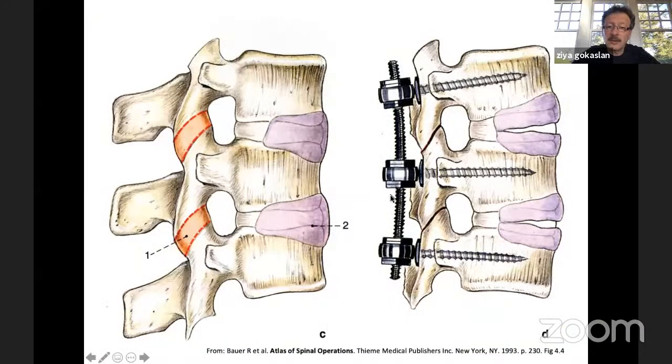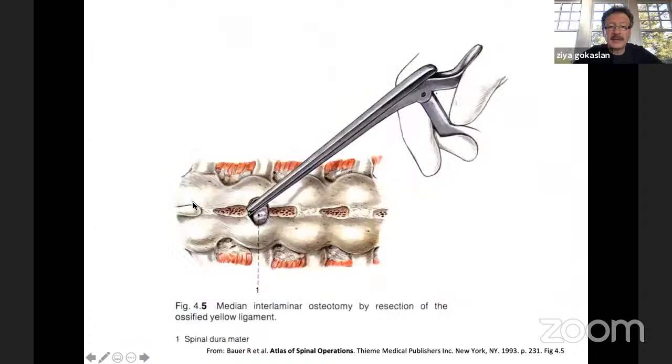Now, we have a series of surgical procedures that we do to correct sagittal plane deformities in the thoracic spine. And these are progressively facet resections, Smith-Petersen or Ponte osteotomies, pedicle subtraction osteotomy, and then finally, vertebral column resection. All of these techniques are highly effective in shortening the posterior column and restoring the patient's sagittal balance.